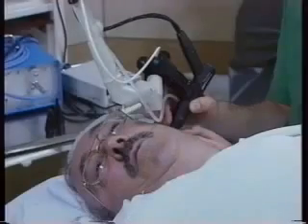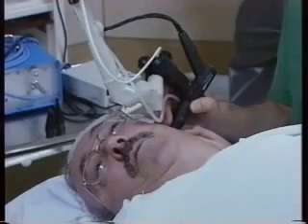The laser is shot on the lower front part of the pars tensa, the usual place for paracentesis. Here the eardrum is perpendicular to the laser beam, which gives a nicely round perforation, and there's no subjacent noble structure which could be destroyed, the ossicular chain for example.